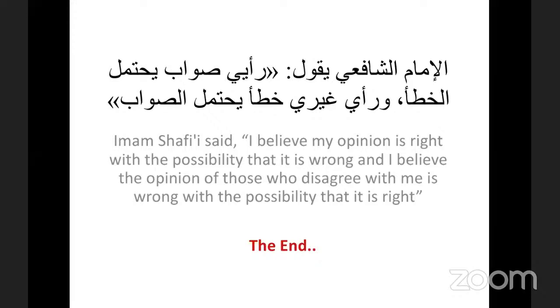However, in my hospital, yes, we document the percentage of the abnormal cells, the percentage of immature cells or blasts or whatever circulating cells in the peripheral blood. We put a full report for the peripheral blood smear even before the result of the bone marrow. And in the bone marrow report, we include the peripheral blood smear as a part of the bone marrow examination.